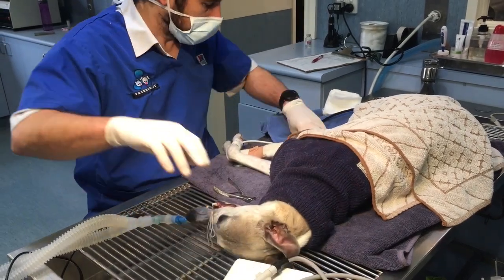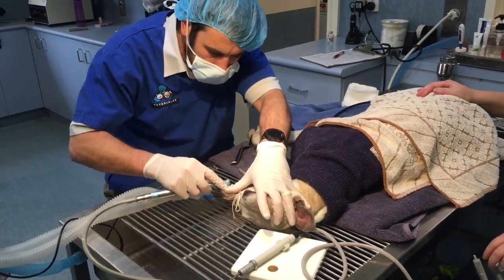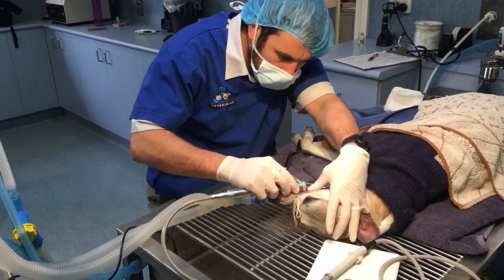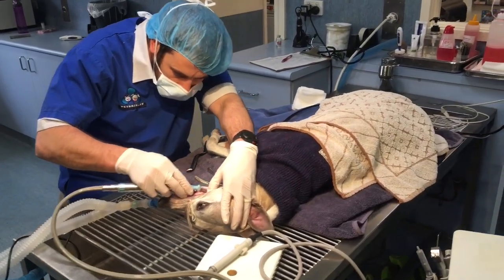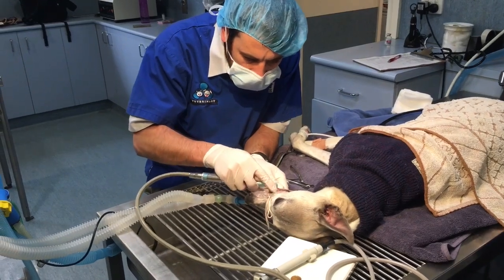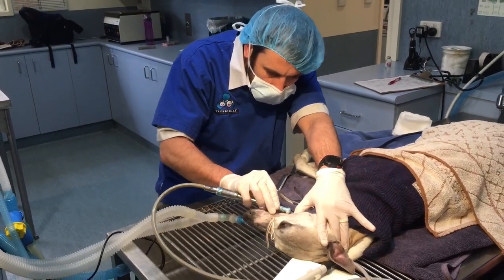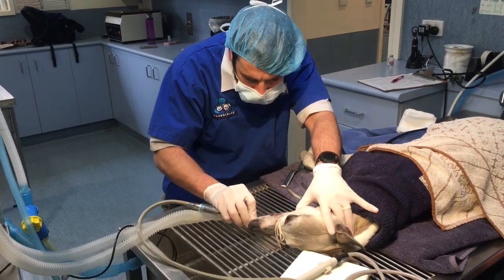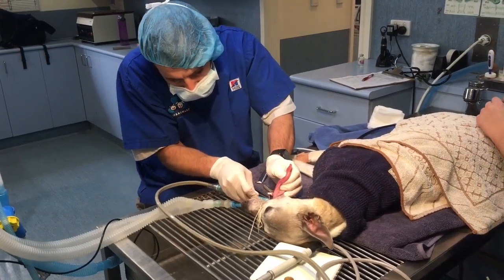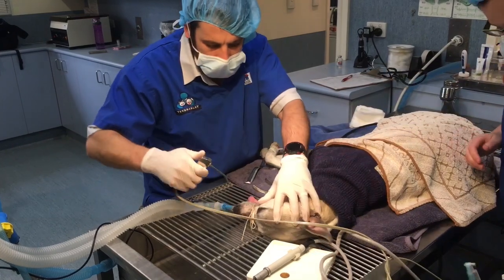Polishing, polishing. We can start to wake her up. I'm probably not going to worry about trying to brush Rosie's teeth for a day — give those gums a chance to settle down a little bit. But tomorrow I'm going to start brushing her teeth. She should be on her normal food given that I haven't had to do any extractions. Flush — and then Rosie is done, so she can go off.